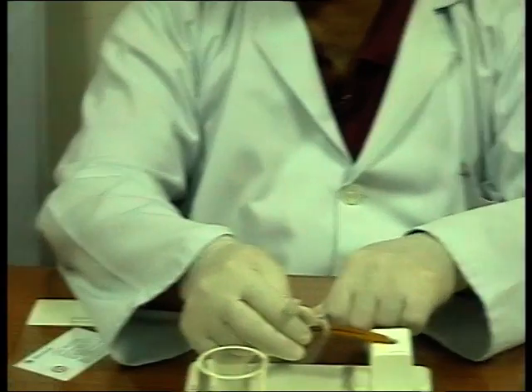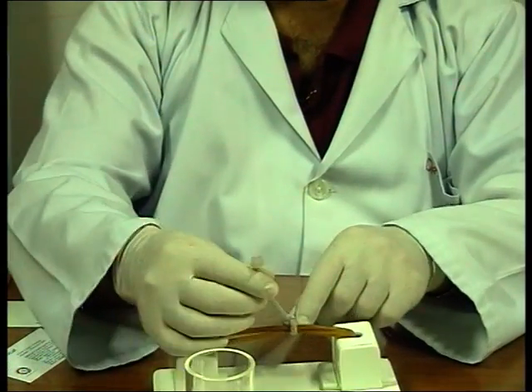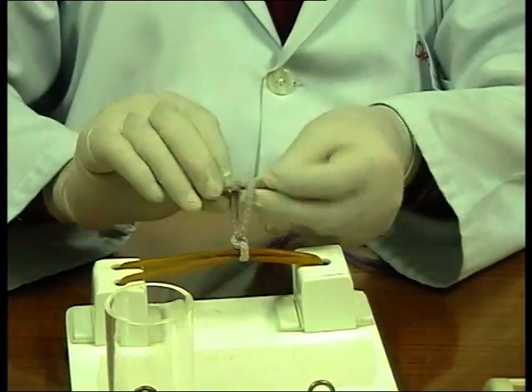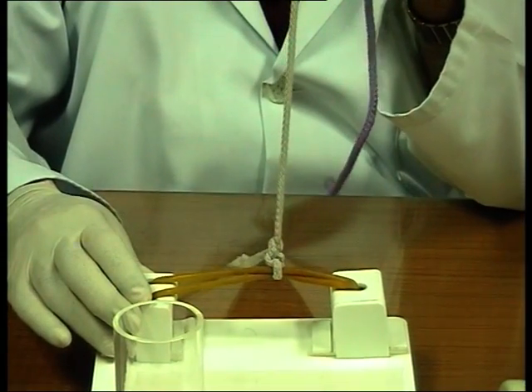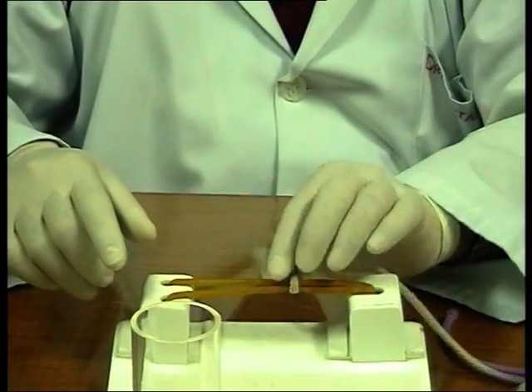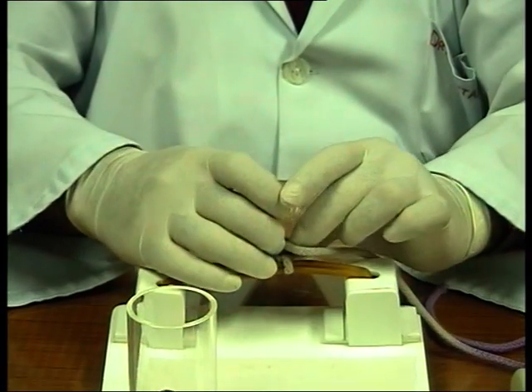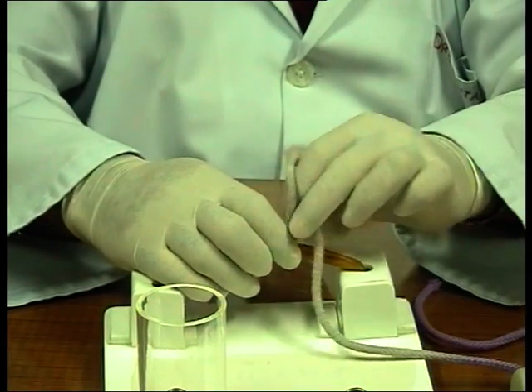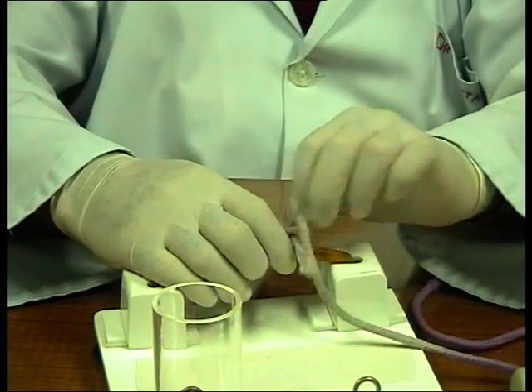Now if I want to use it, now the instrument would be off. Bleeding would have stopped. Now the short end is away. I'll put a proper index finger throw. So now this is secure. So you put a slip knot to reach the place or beyond that instrument and put a secure knot on top of it to make sure that it does not slip out. Initially you want it to slip, later on you don't want it to slip.